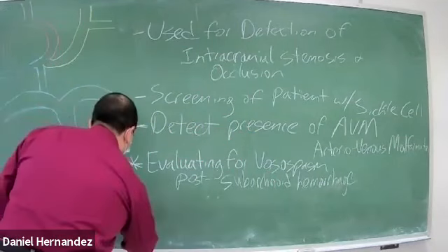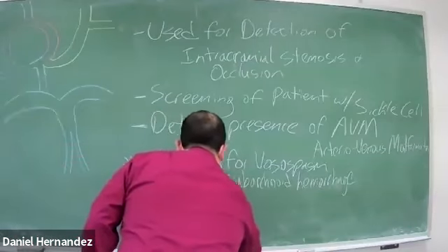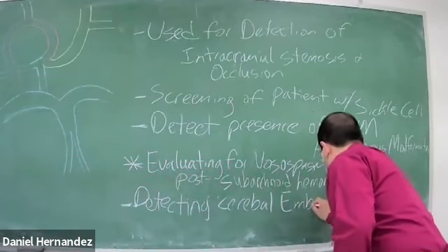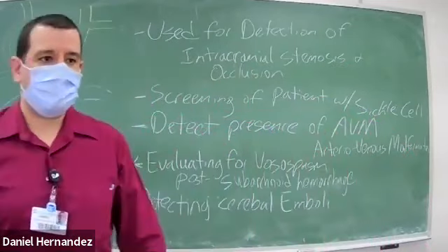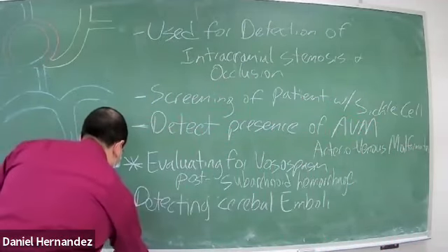We also use it for detecting cerebral emboli, as well as the detection of brain death.